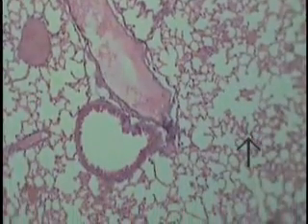It ends like a little cluster of grapes if you cut it in that fashion. This is where the respiratory passage will terminate in a succession of alveoli. This is perhaps one here, but cut at an angle. If one can envision this alveolar duct coursing like so and coming here, then it'll end in maybe 5 or 6 alveoli, and this is where the epithelial lining will actually stop. And that'll be the end of this branching tubular system.